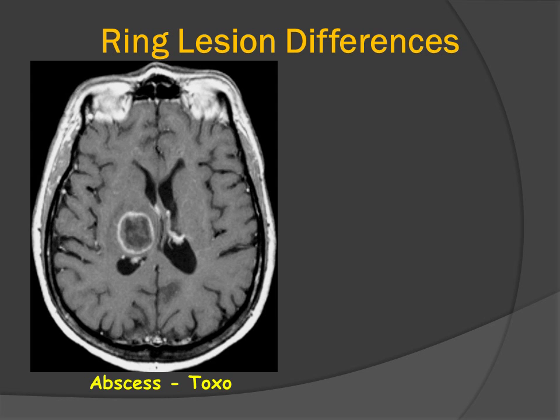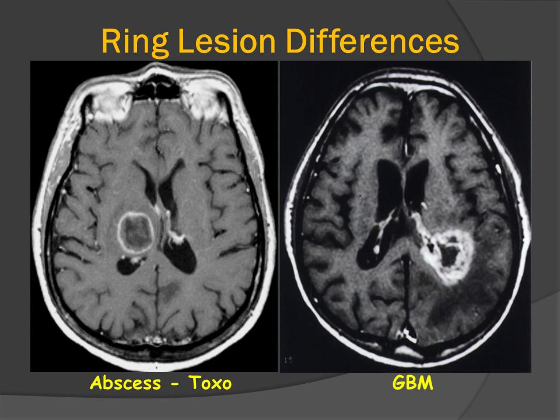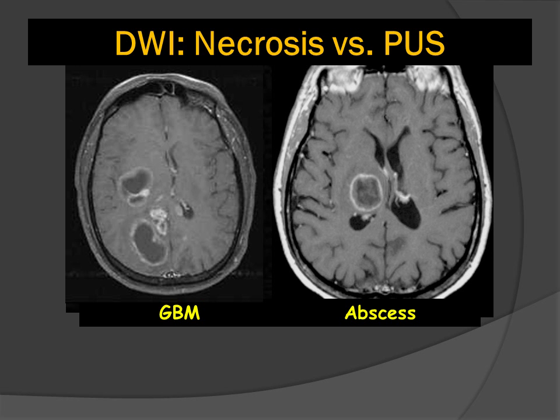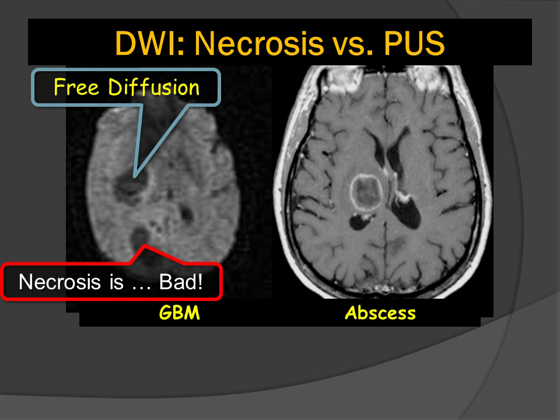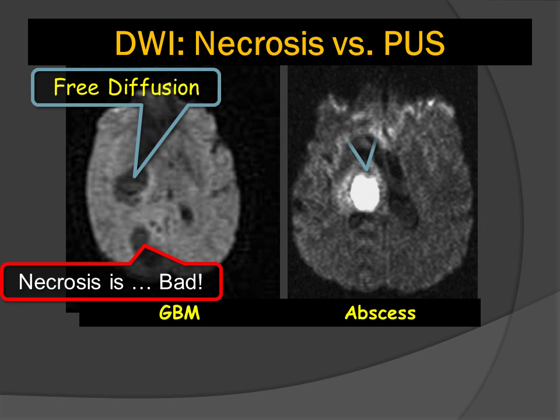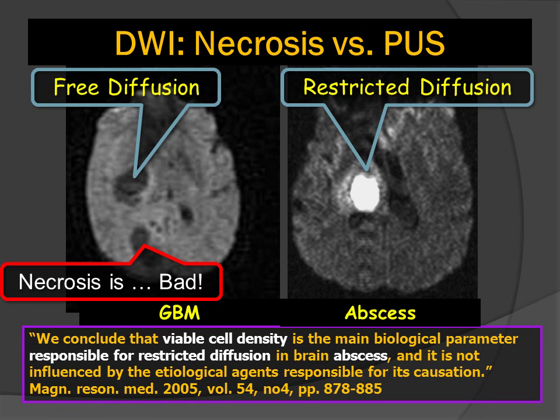Comparing an abscess of toxoplasmosis with a necrotic neoplasm (GBM), we can see how different the rims are — one is thin and smooth, the other is thick and irregular. On side-by-side DWI, the GBM shows a multilocular appearance with increased diffusion from necrosis, while the abscess shows restricted diffusion from pus. The primary cause of restricted diffusion in an abscess is viable cells, typically macrophages.